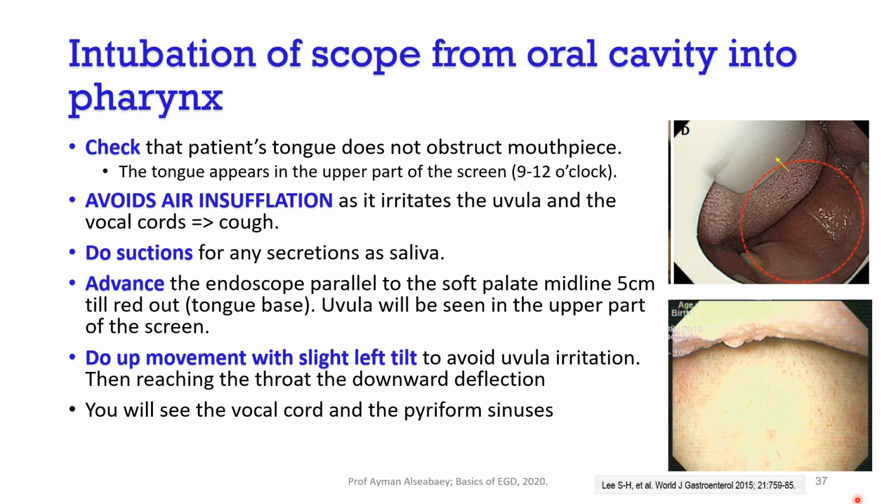But it can be used during EUS, and can be used during ERCP, because ERCP, as you know, uses a side viewing duodenoscope. So it is always better to have vision, especially if you are suspecting some pathology like Zenker's diverticulum or malignancies in the throat.